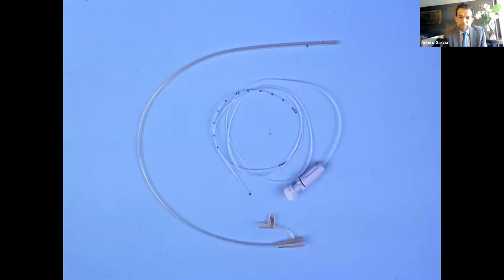This is very useful because when the patient gets to the maximum cystometric capacity, you can remove the UPP catheter, and then the patient is left only with a very, very thin tube inside the urethra, and the pressure flow study you're going to get is much more similar to a normal void the patient has.